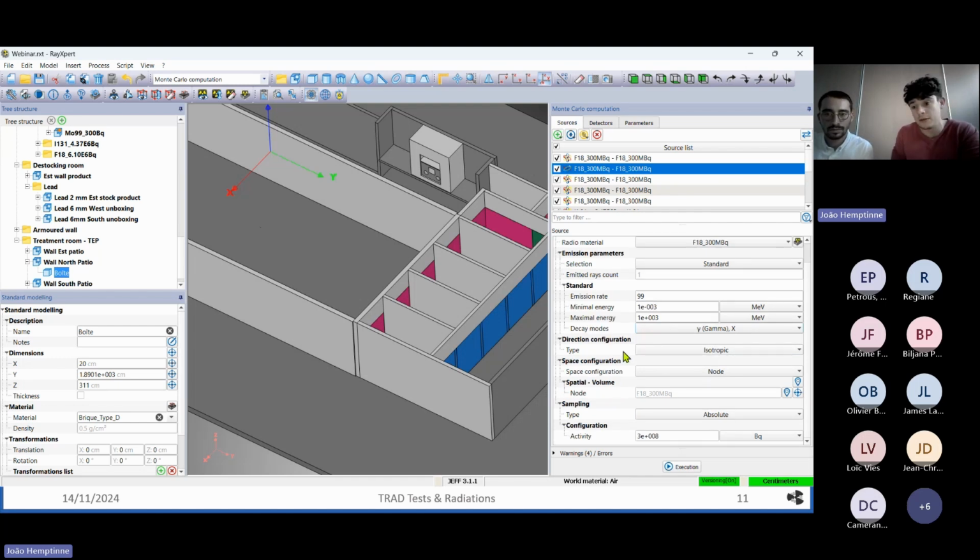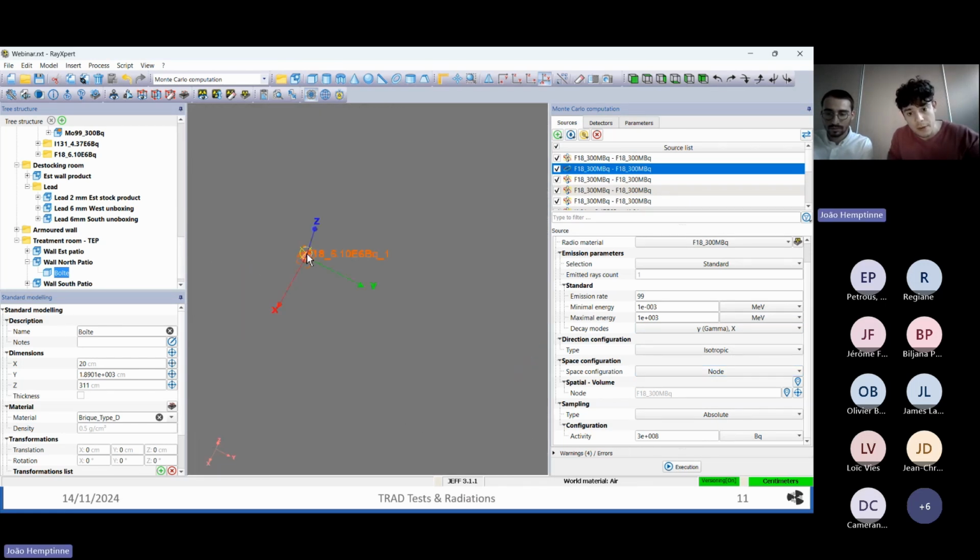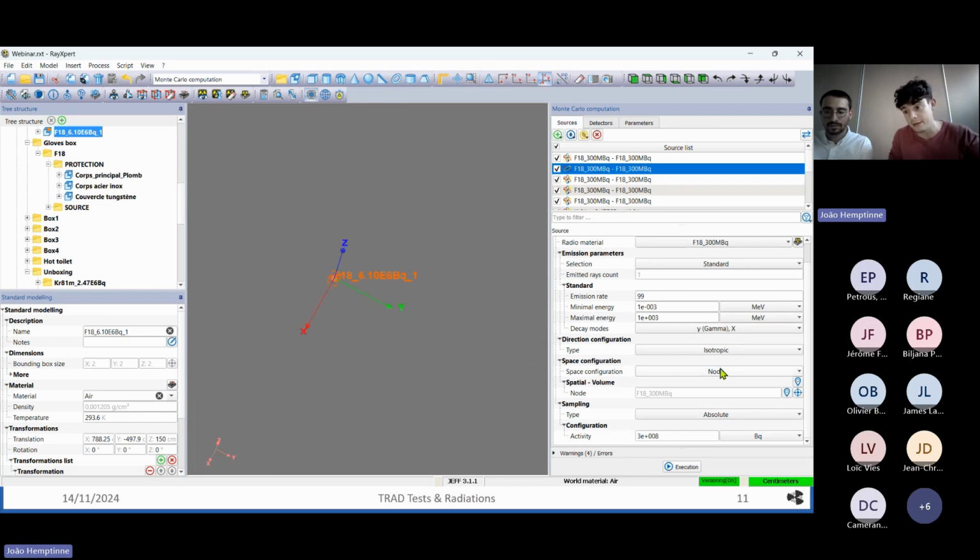And here you got different configurations, isotropic, so where the rays are going to be emitted and from where. Here I select the node, so I create a sphere here in the middle of the room, and I just assign to this sphere the source, and all the rays are going to be emitted from this sphere. And the final step is to set the activity of the source.